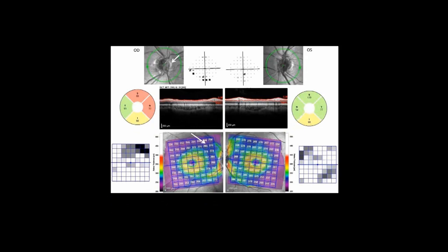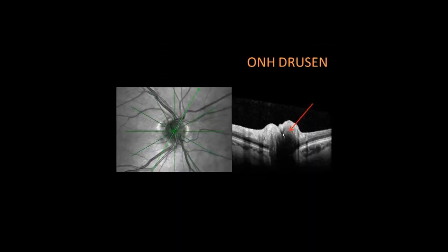Here is another glaucoma suspect with an inferior arcuate scotoma and an unusual nasal loss. There is a loss of nerve fiber layer, but there was something we were not confident about until we took an optic nerve scan. We could have easily labeled this as glaucoma — inferior arcuate scotoma, superior macular thickness abnormality, superior nerve fiber layer loss. But when we did scans through the optic nerve, we were able to pick up an optic nerve head drusen that was buried. You can see the homogeneous shadow caused by that drusen.